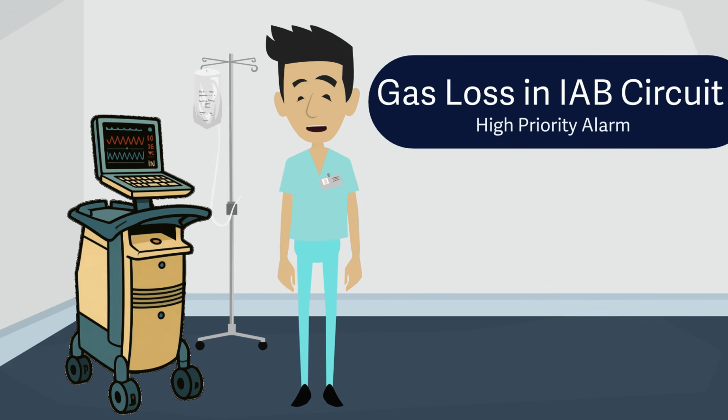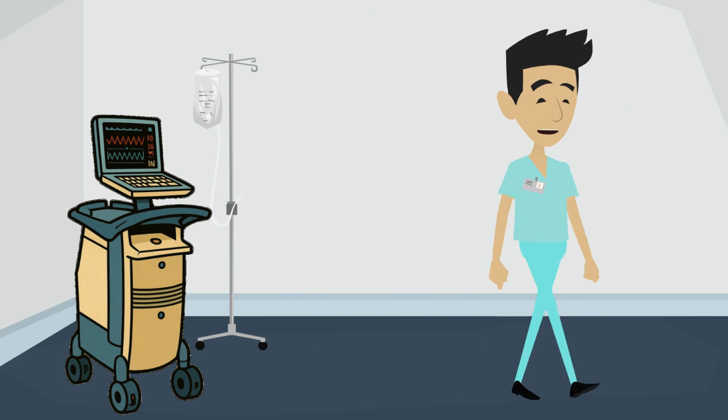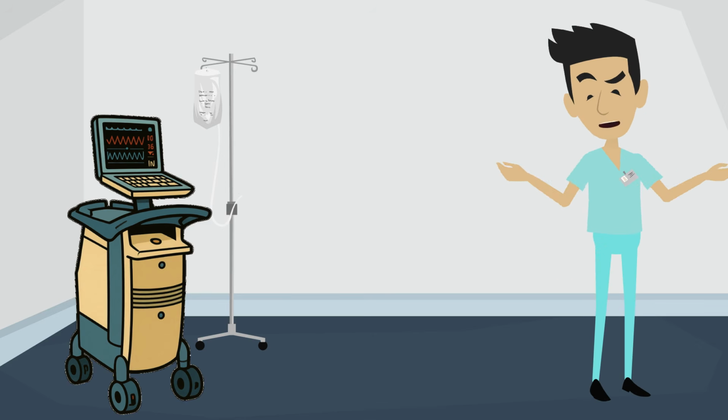Gas loss in the IAB circuit is a high-priority pump alarm that you may see on the monitor display during therapy. What does the gas loss in IAB circuit message mean in IABP therapy? And what should you do when you see it? Let's take a closer look.